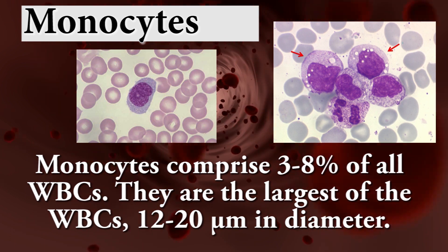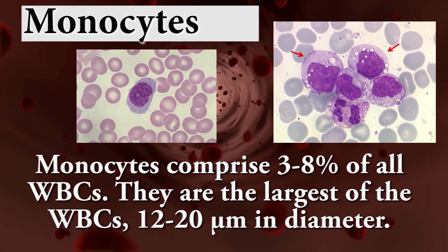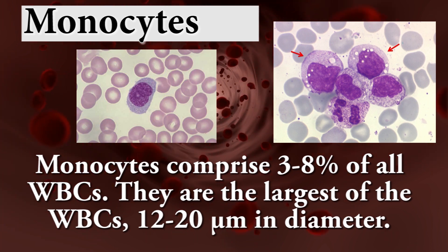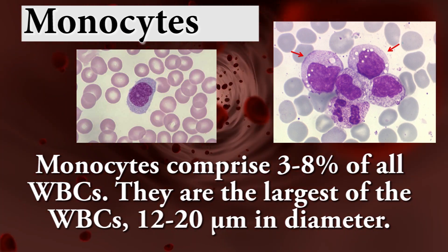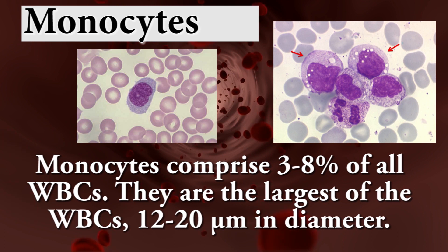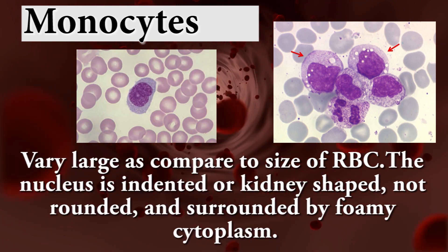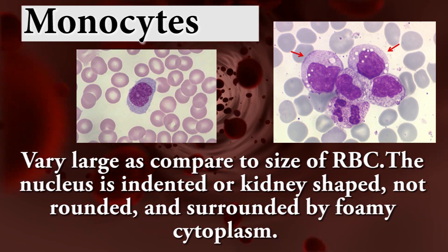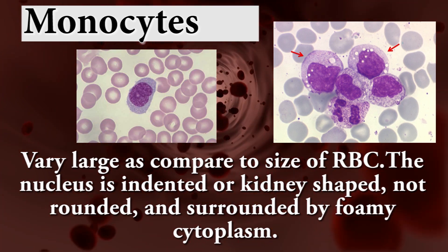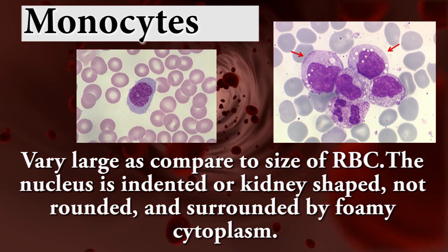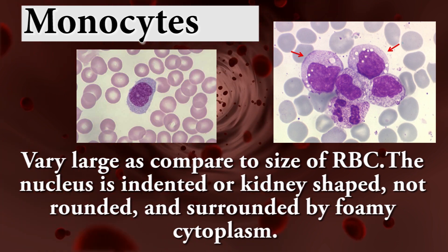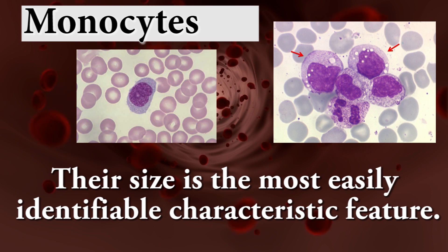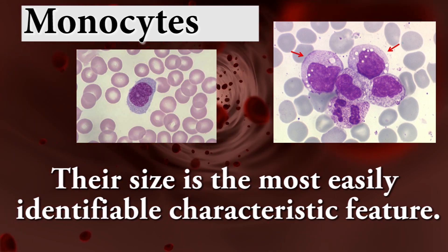Monocytes comprise 3 to 8% of all WBCs. They are the largest of the WBCs — 12 to 20 micrometers in diameter — very large compared to RBCs. The nucleus is indented or kidney-shaped, not rounded, and surrounded by a frosted cytoplasm. Their size is the most easily identifiable characteristic feature.